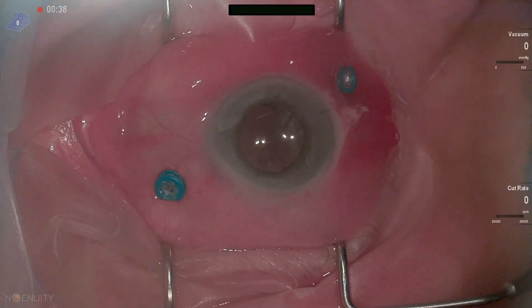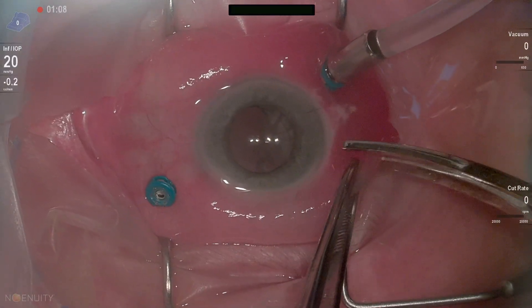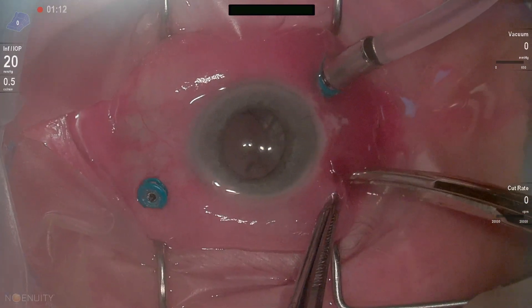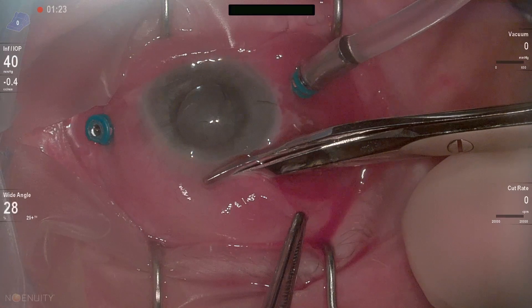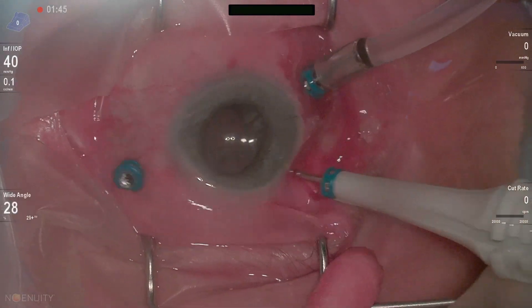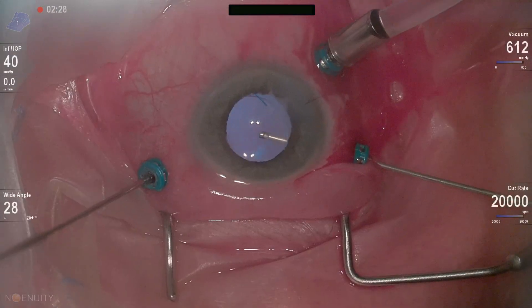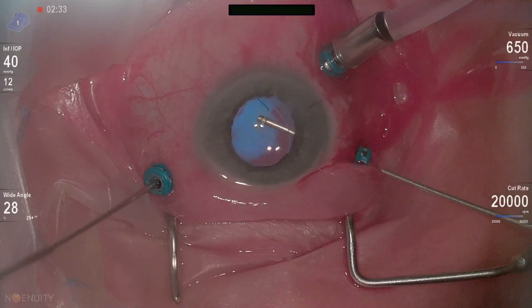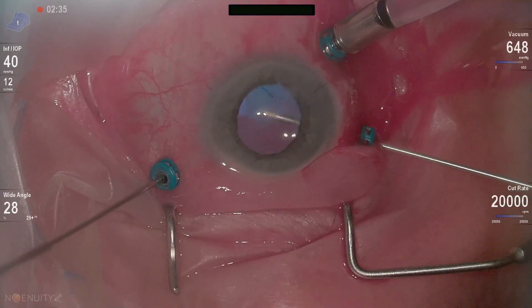Anterior segment surgeons and optometrists alike always want to know what it's like to remove a dropped lens from the back of an eye. I know this is a really devastating complication in most people's minds, but when referred promptly and managed appropriately, these patients can do absolutely really, really well. And I'll show you how we take care of this.